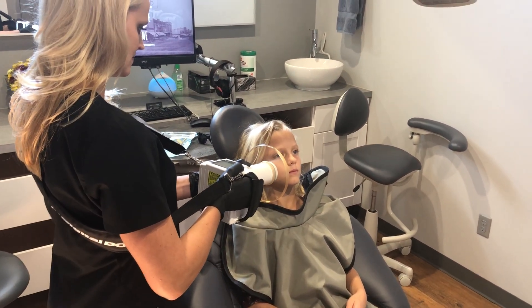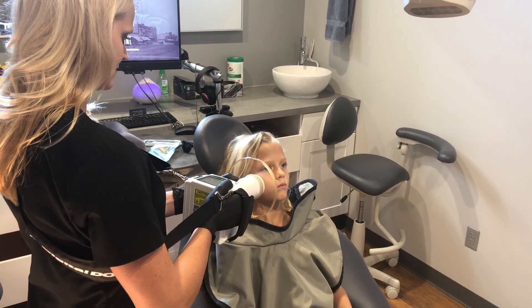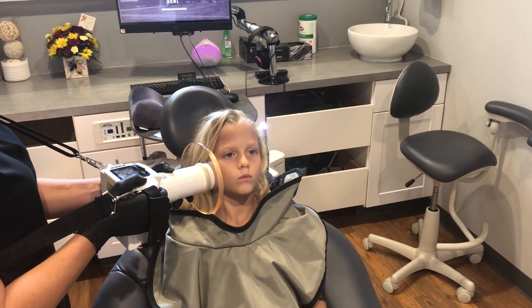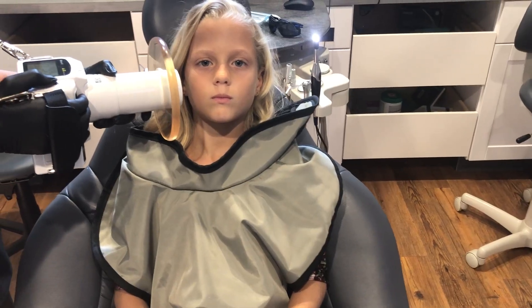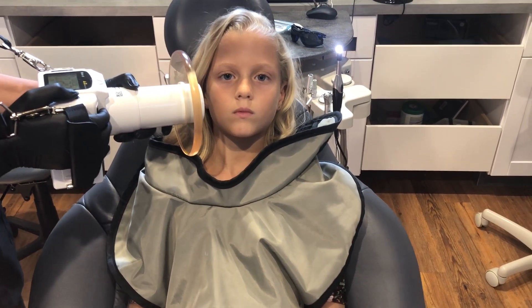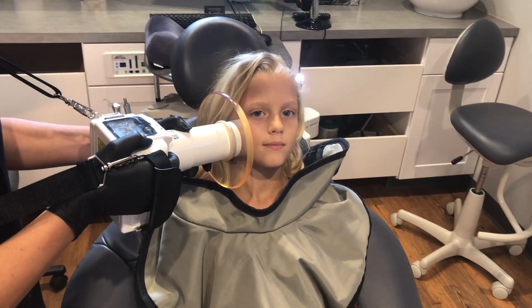You'll notice she's taking the XTG and pushing all the way out. Good position there with the patient. Notice how we're getting really close to the cheek — as absolutely close to the cheek as we possibly can go. Now Kayla doesn't have a sensor in her mouth; I'm not taking live x-rays here, just showing the positioning.